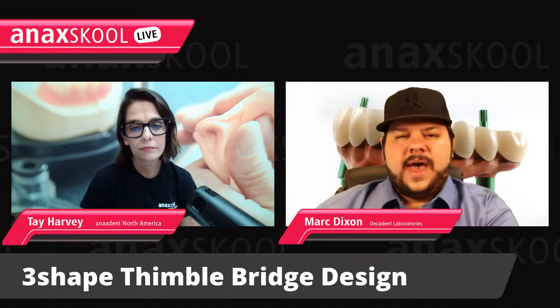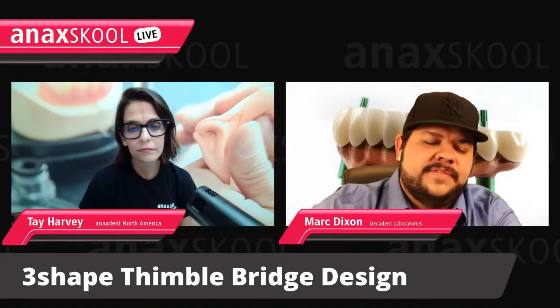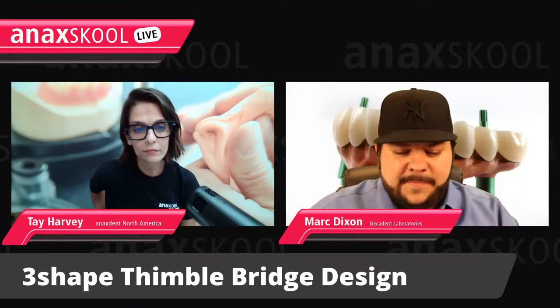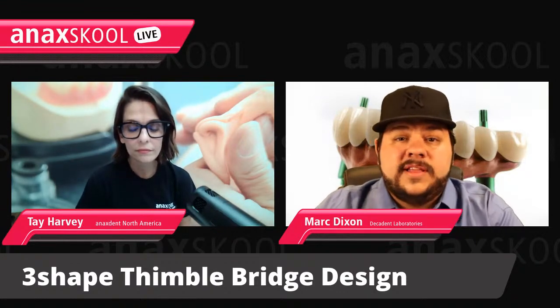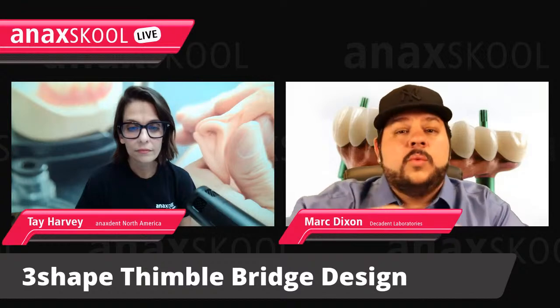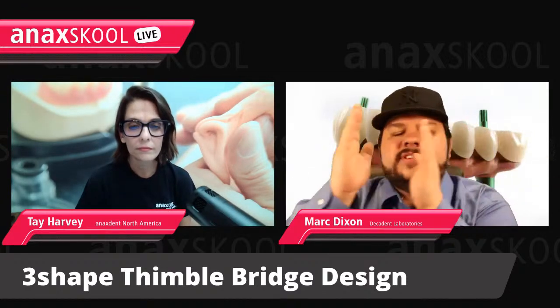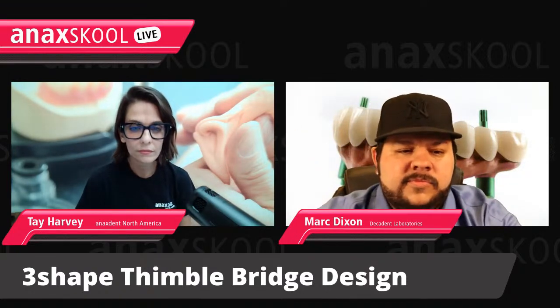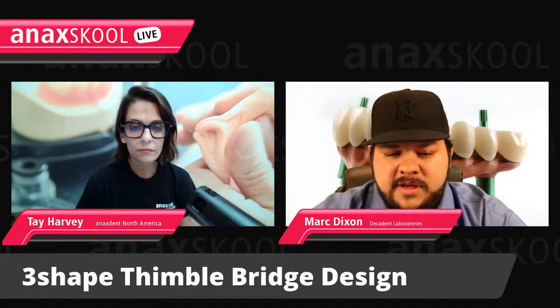In exocad, while you design, when you hit save, it saves everything in a scene. You can recall that information any time of the day. With 3shape, every move, every operation, every click, every time you hit enter, control, whatever, it gets recorded and saved into the design tree, and the design tree is separated into different parts of your tooth type indications.